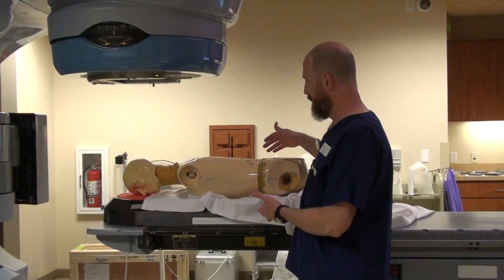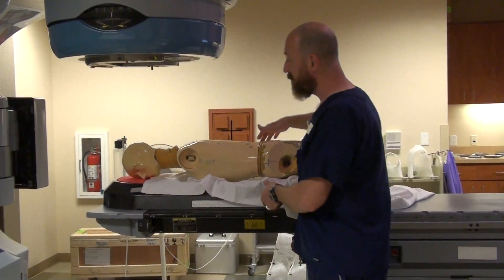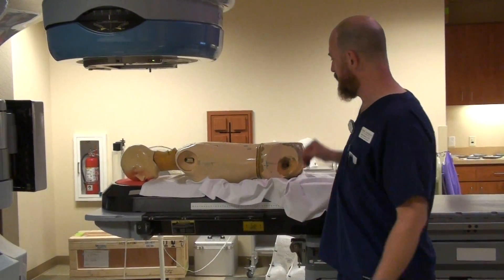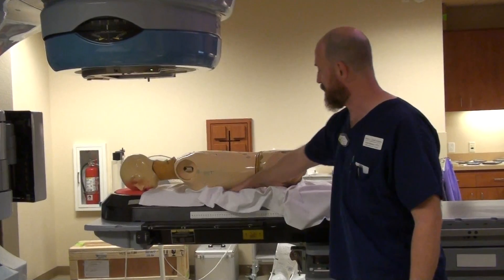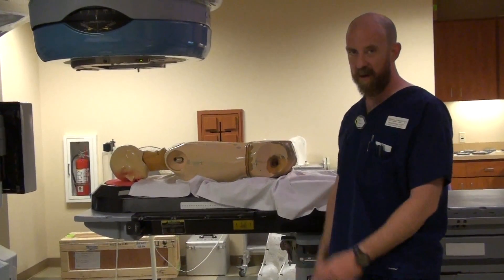Once you're set up and you go to touch the patient for the first time, tell them, 'I'm going to roll you now, I'm going to touch you' — or something to that effect. Just make sure that they know it's coming. Make sure all clothes are pulled down into the side of the bellyboard hole, not holding up on the patient.